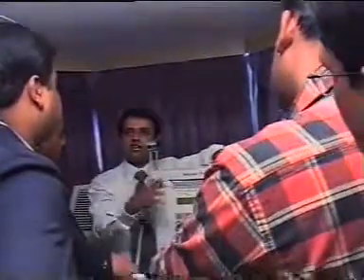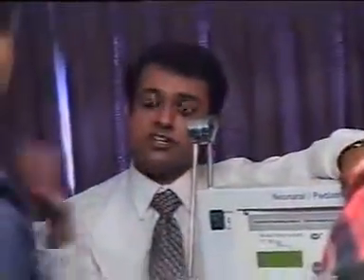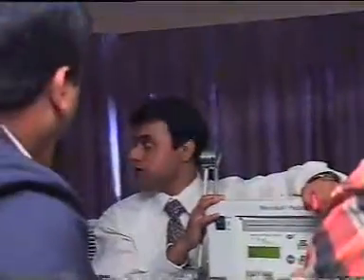Coming on to the last of the settings, if you increase the inspiratory time, oxygenation increases. And what happens to the carbon dioxide? It will increase, that's right. Why? Very true, we'll come to that point.